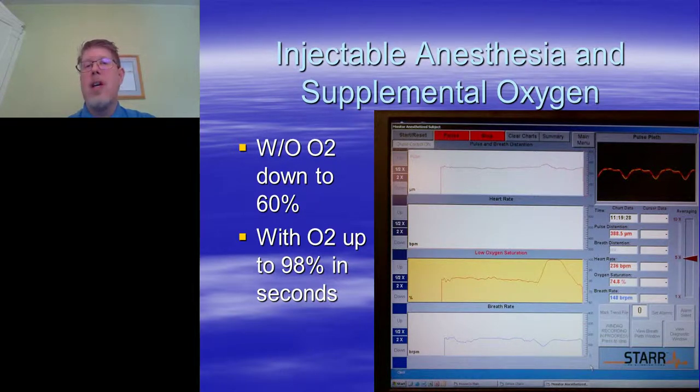again, cascades through, because if you damage the cardiovascular respiratory center because of your anesthetic protocol, again, your data is compromised. It can take hours to days to even weeks for that damage to recover in an animal if we're using a poor anesthetic protocol. And again, the whole point of the study is to get good data. Now you compromise your animal.